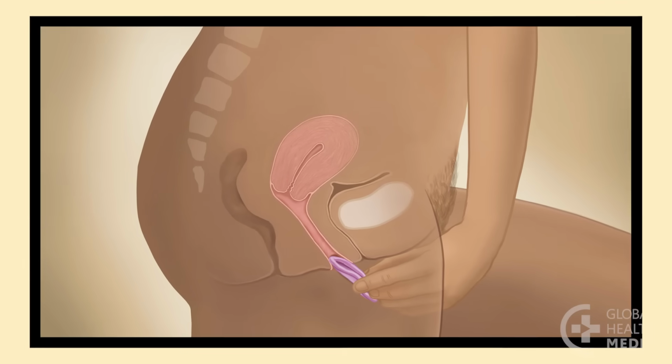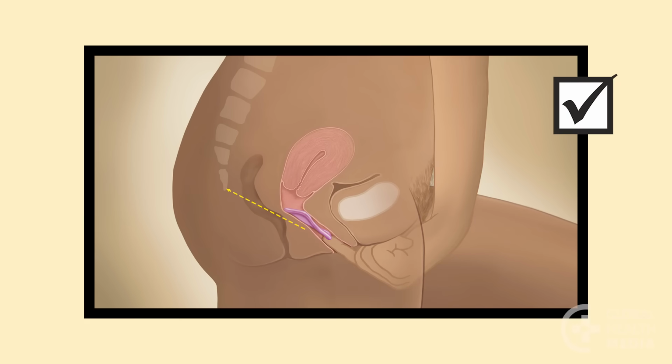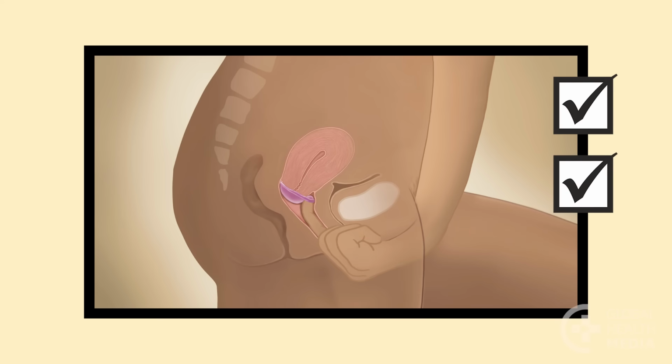Keep these points in mind. Insert the diaphragm in the direction of your tailbone. Push it all the way in and tuck it behind your pubic bone. Check to be sure the diaphragm covers your cervix.